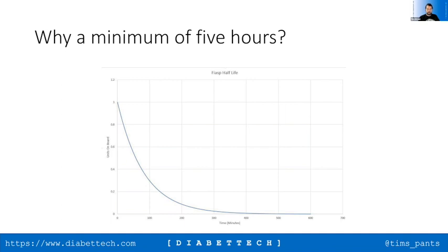Typically, what will happen is that you tend to notice it overnight, or you'll tend to notice it when you exercise a long time after a meal. That tends to be the time that you'll pick it up, is that you will have no obvious IOB, you potentially will have negative IOB, have no COB, there should be nothing really going on, and you'll have repeated incidences at different times of day where you end up with glucose levels. Generally, you'll find yourself hypoing. The way I identified it on my setup was that I was seeing hypos for no obvious reason that didn't tie in with an insulin carb ratio or an ISF change or a basal rate quite a long way after insulin had been administered, other than what I was expecting to do.